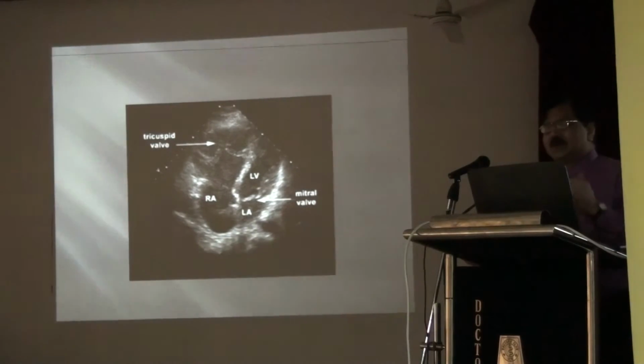So Ebstein is not a rare disease. In the last 10 years we have got 4 to 5 series of Ebstein, and reports are also saying Ebstein patients can live up to even 70 years. They have reported. So 25-30 Ebstein cases we are getting. So this is how you can see it on echo. Very easily we can see that it is the Ebstein anomaly, and look and follow.